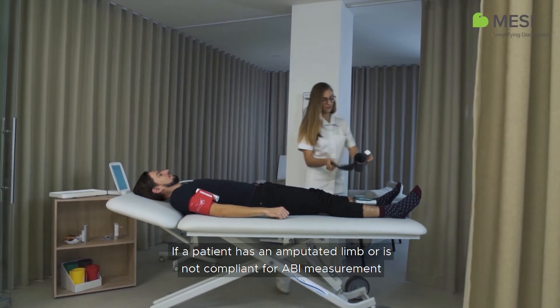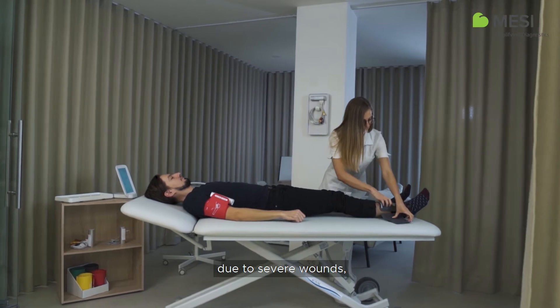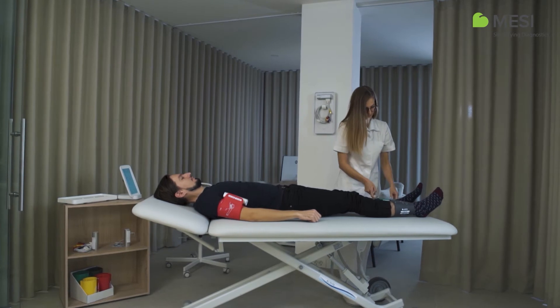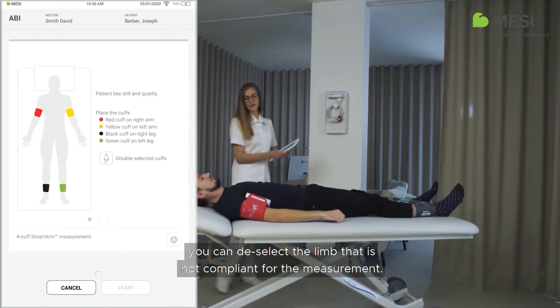If a patient has an amputated limb or is not compliant for ABI measurement due to severe wounds, the ABI can be measured only on the patient's compliant limbs. Before the measurement, you can deselect the limb that is not compliant for the measurement.